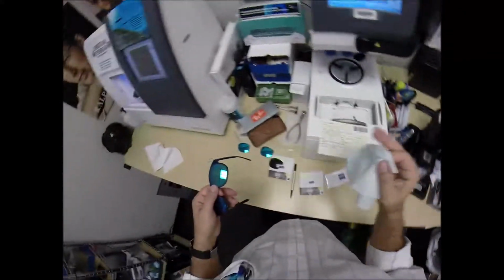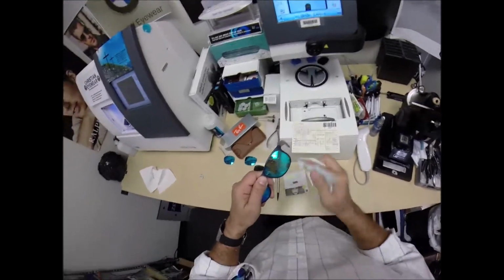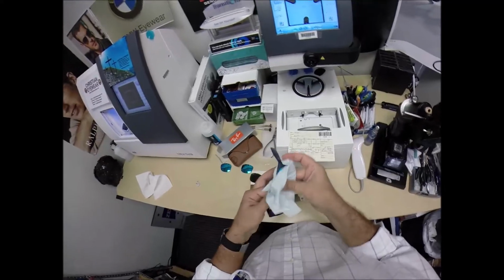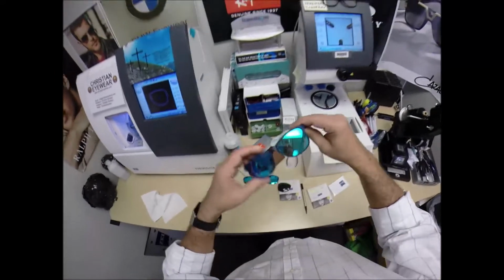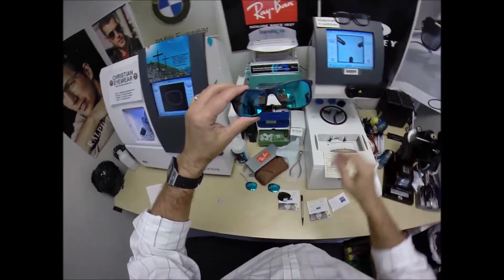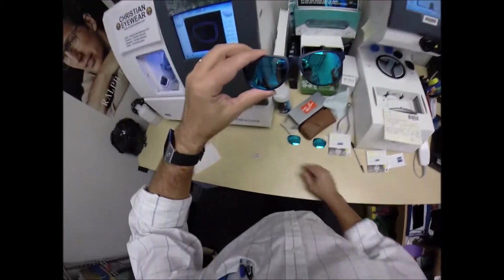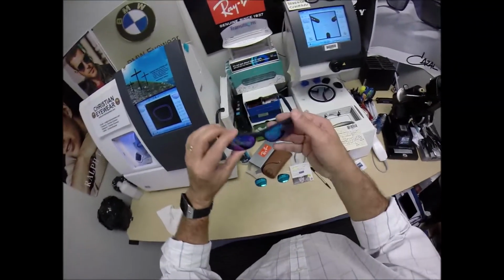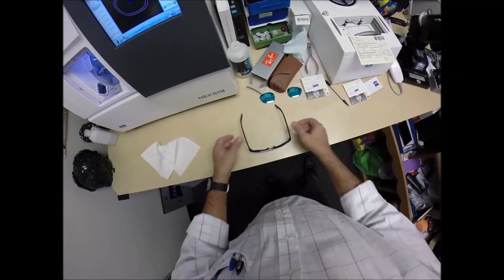Now this is the portion in every video that, as I clean your lenses, I mention, Jorge, when you get these in the mail in Gaston, South Carolina, there's a small chance that these could fit too loose or too tight. However, there's an 80% chance that one side is going to sit higher than the other. That's because 80% of people have one ear that is higher than the other. And I'm part of that 80%. Because of that statistic, 99% of all optical shops will do free adjustments if you ask them. But I'm going to get them in standard alignment, also known as a three-point stance, 1, 2, and the bottom of the frame being 3, set down on the counter and press down.